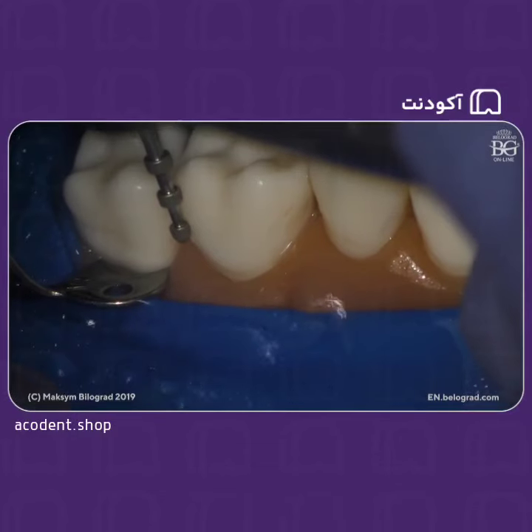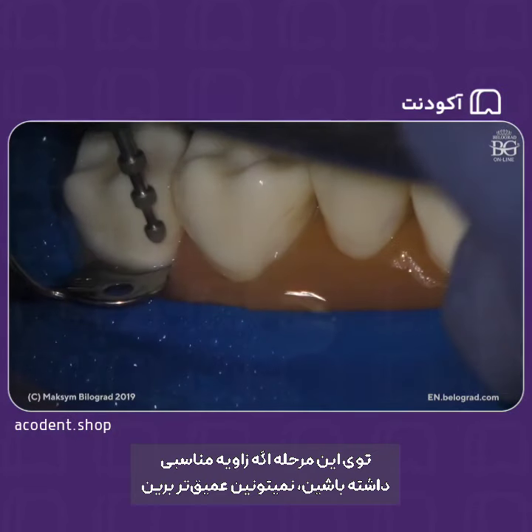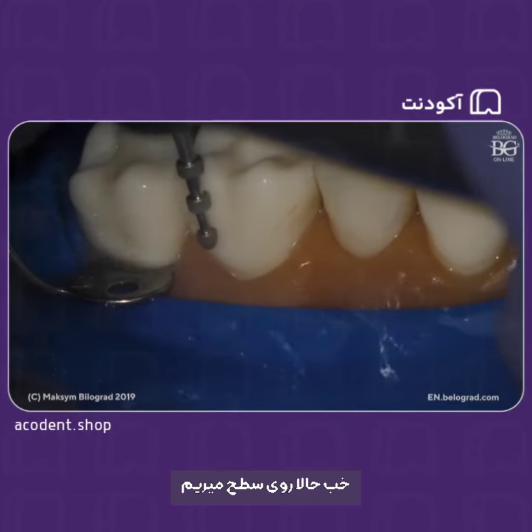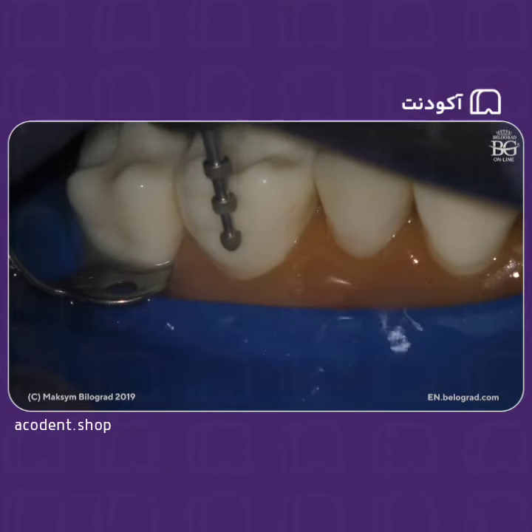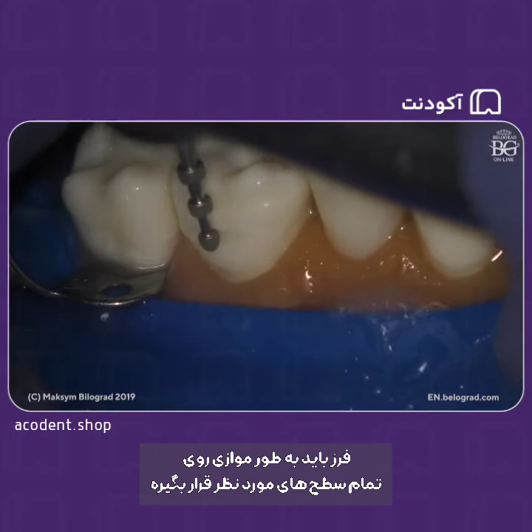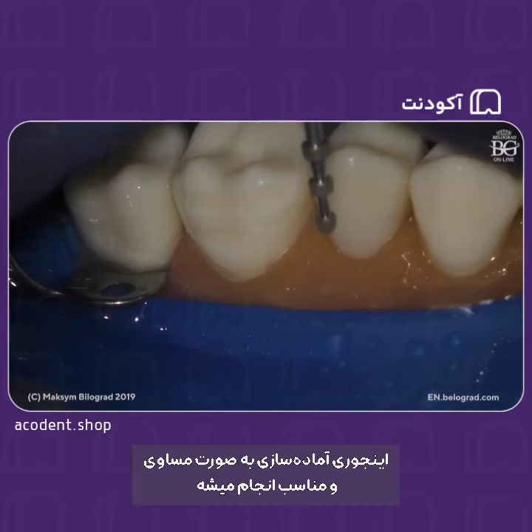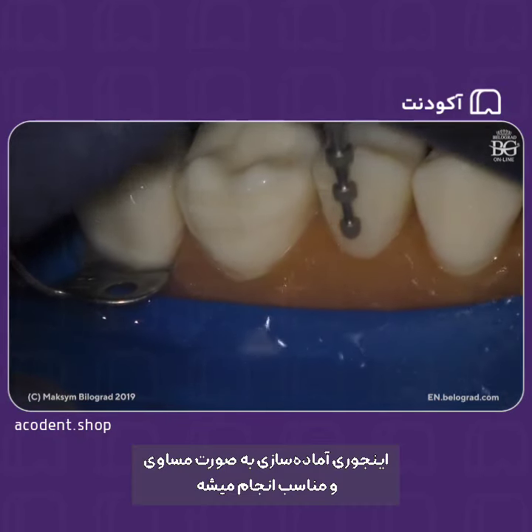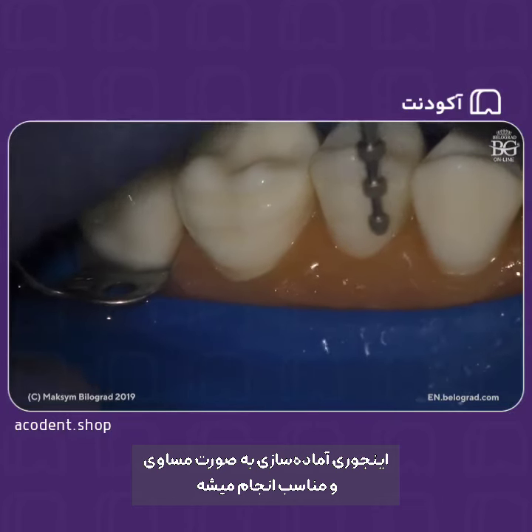You see, if you keep the correct angle, you will not be able to go deeper. So you go within this surface. The burr has to be driven parallel to the surface that you prep. This way you will get equal, or let's say adequate, preparation.